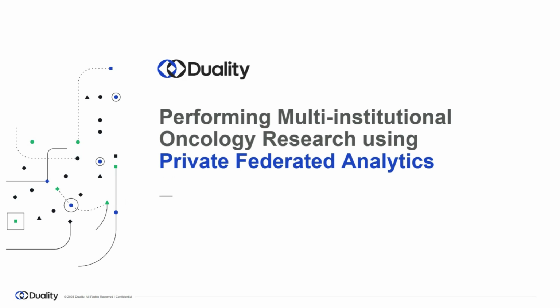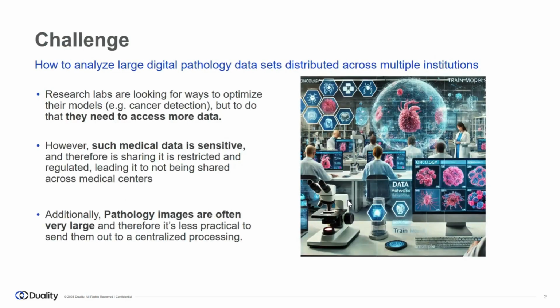My name is Omer, and today I'll show you how Duality enables secure federated learning for multi-institutional oncology research. The main challenge in this space is the need to analyze large digital pathology datasets distributed across multiple institutions.